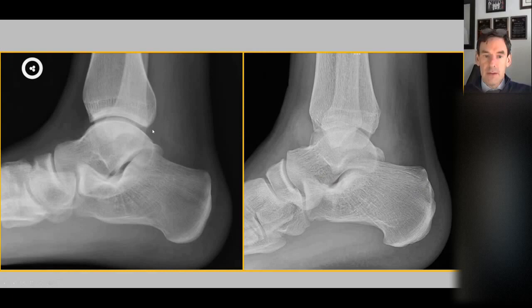In the ankle, normally in the front and the back there is fat. In the presence of an effusion, that fat is displaced and you see these densities, which are joint effusions. This is again a primary finding of a joint effusion.